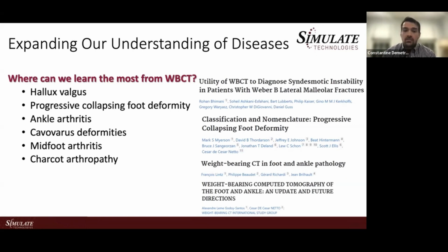Where is the deformity, particularly when they have loss of their arch through the midfoot? Where am I fusing and how am I going to do that? And especially for our Charcot patients, because then really we're looking at a complex deformity and how are we going to correct it to give patients a plantar grade foot.